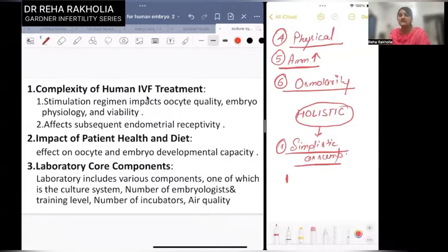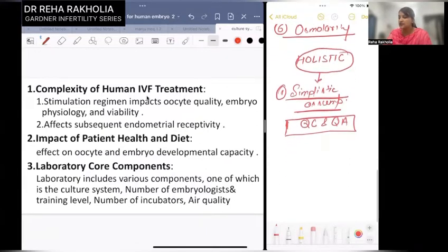Only culture media is not responsible for the result of a given lab or clinic. QC and QA, quality control and quality assurance, significantly impact the success of IVF. I'll talk about it in another lecture. Second is health and diet.